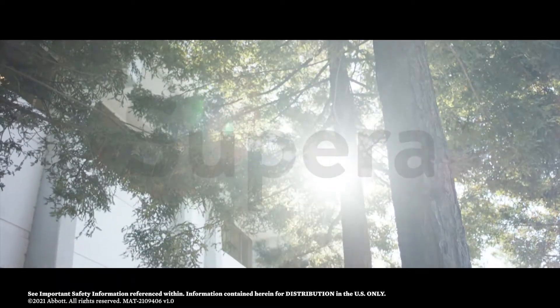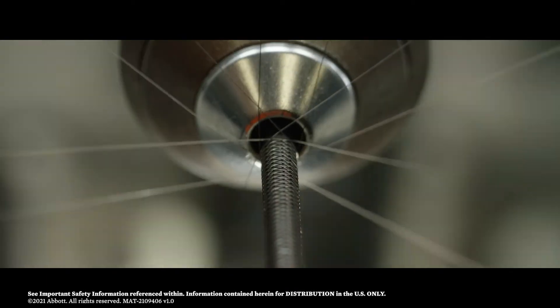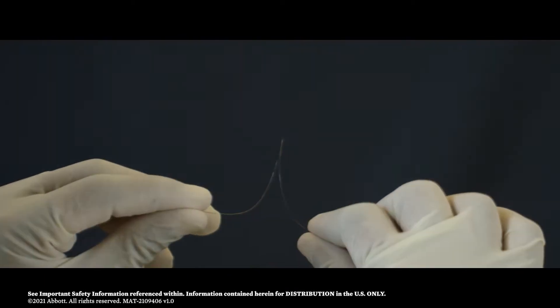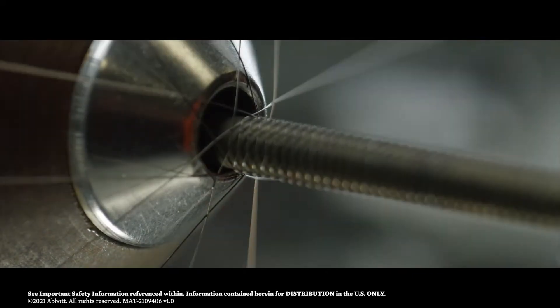Supera is designed and manufactured much differently, starting with individual flexible nitinol wires — an advantage from the very beginning, in contrast to starting with a rigid nitinol tube.